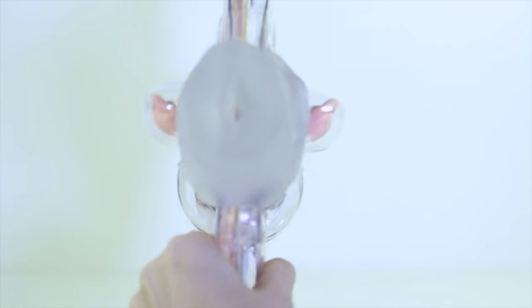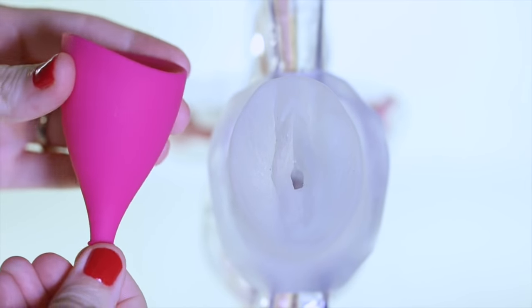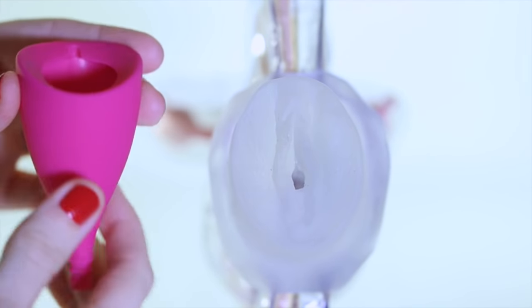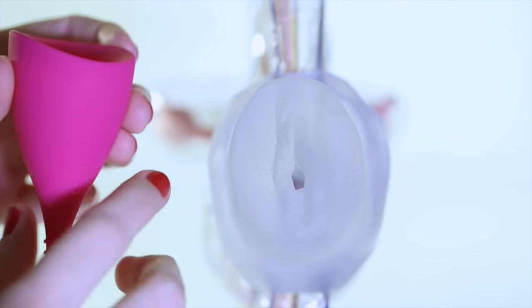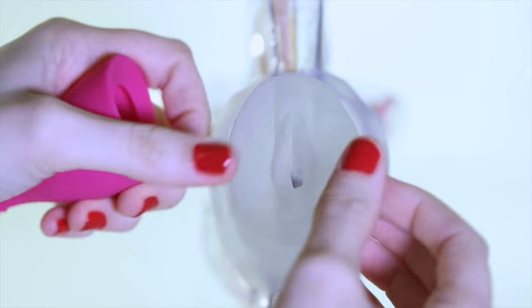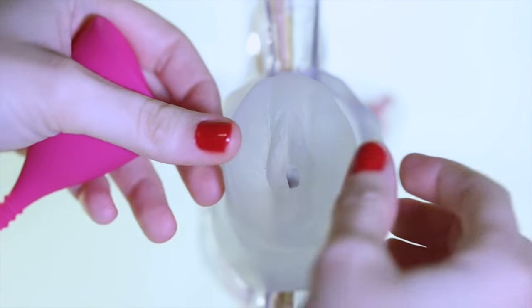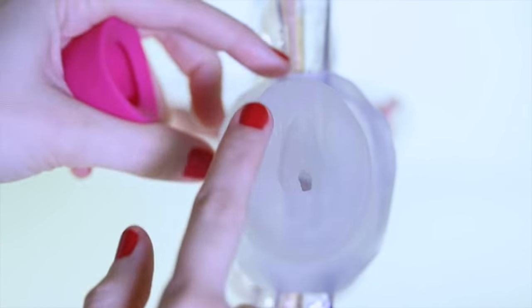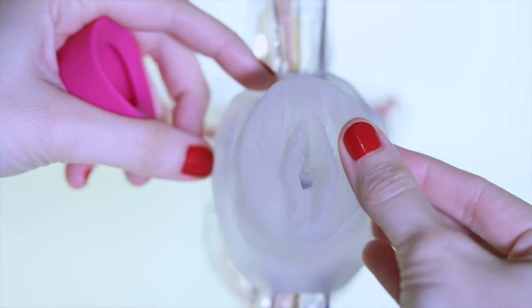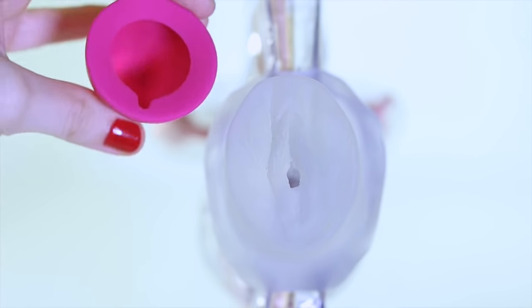Next we're going to show an insertion using our pretend vulva. For demonstration purposes today I'm going to use a Lily Cup standard size 2. This is a really nice and long cup, very smooth to the touch without a rim, and it's very good for people with a high cervix. These are the outer lips and then this is the inner lip, and you can kind of see how we're going to be doing things here.